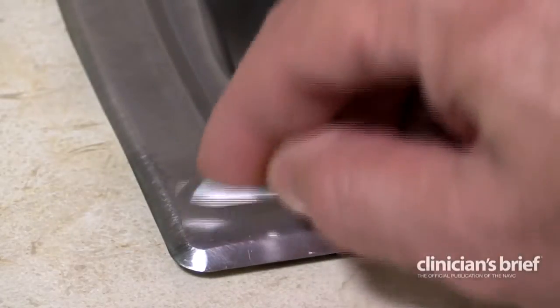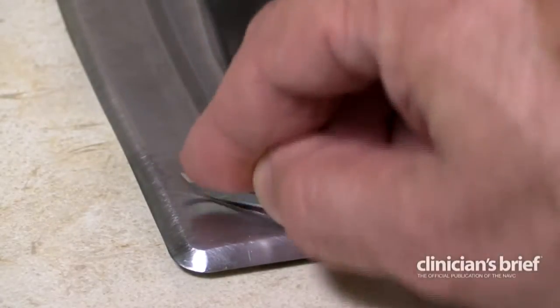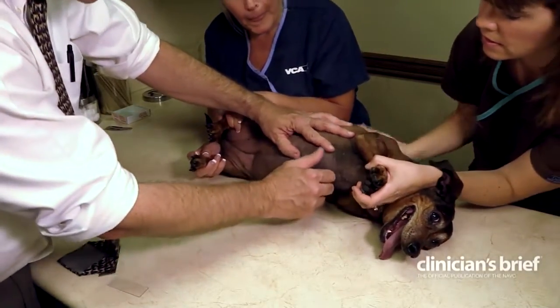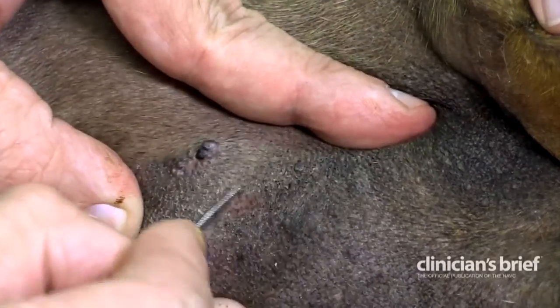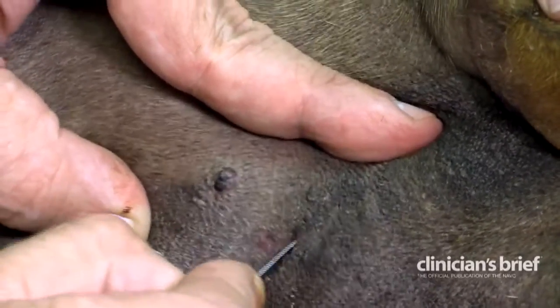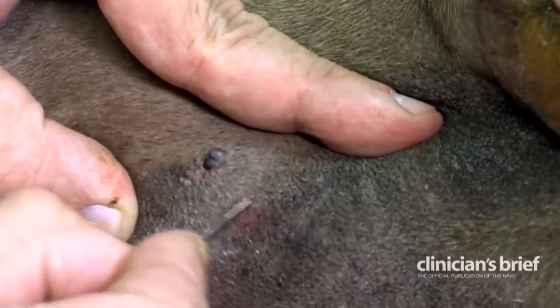Many clinicians prefer to dull the scalpel blade on a metal surface prior to scraping. Identify the desired location for the deep skin scrape, gently retract the skin, and scrape with the dulled scalpel blade. Deep scrapes have the highest yield when performed until capillary bleeding is observed.